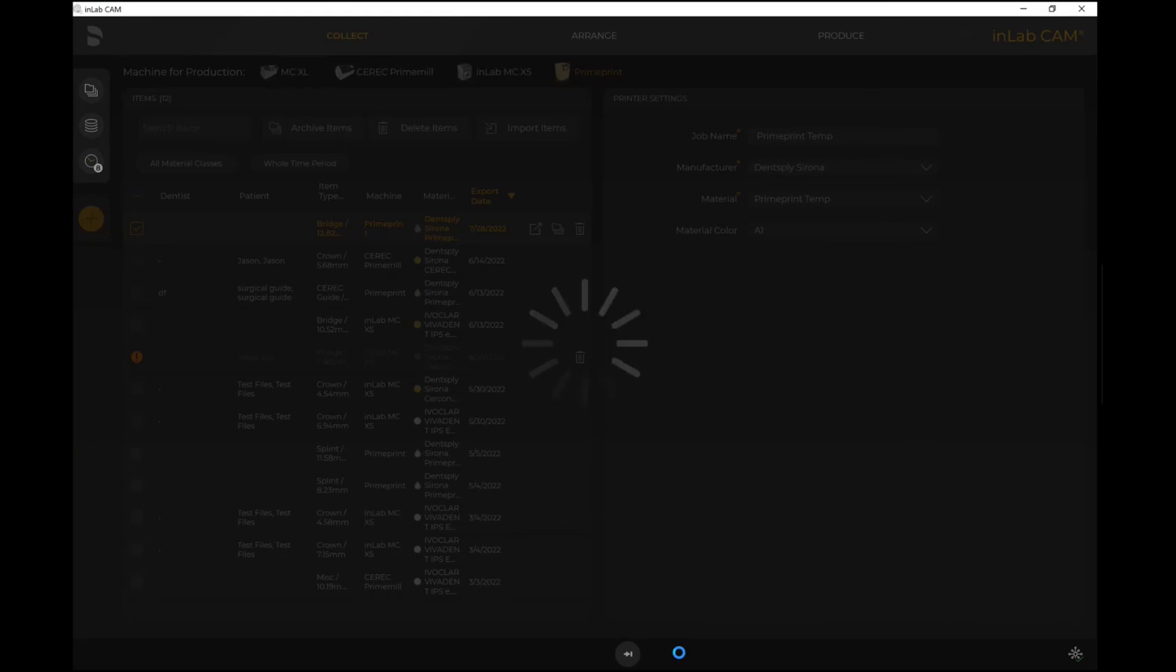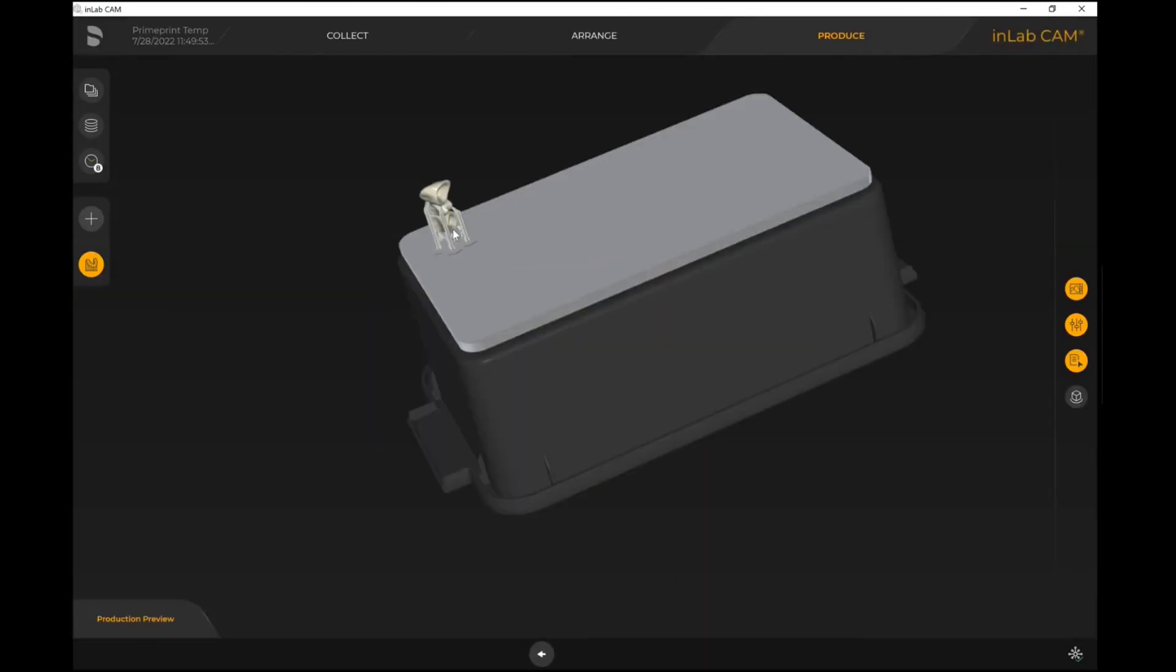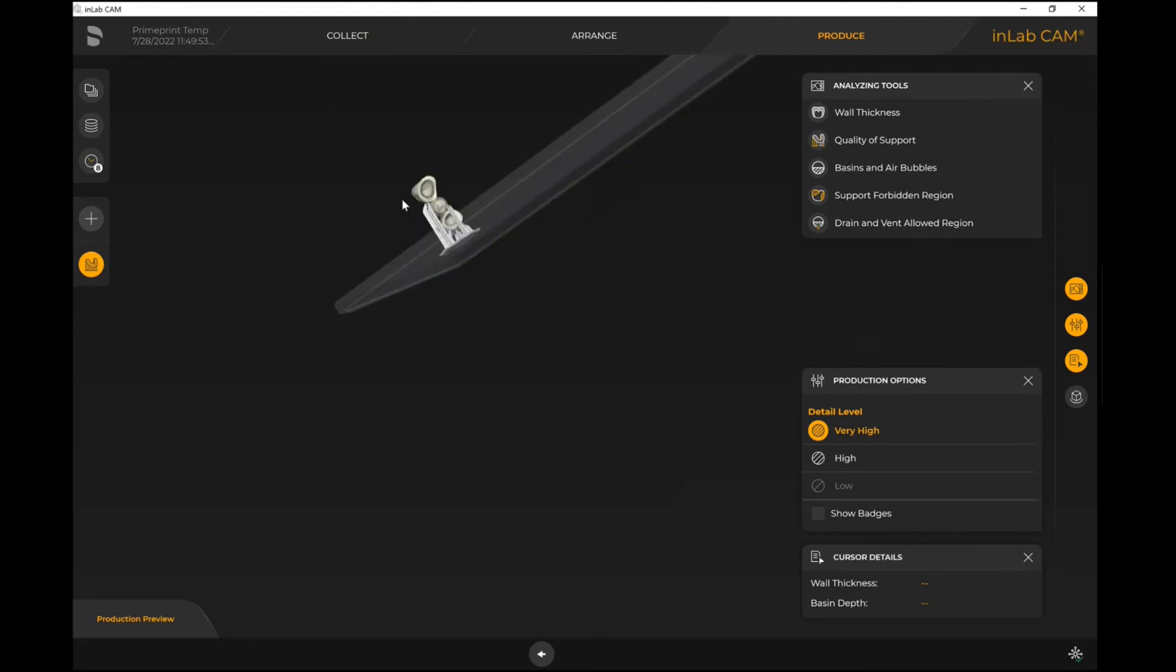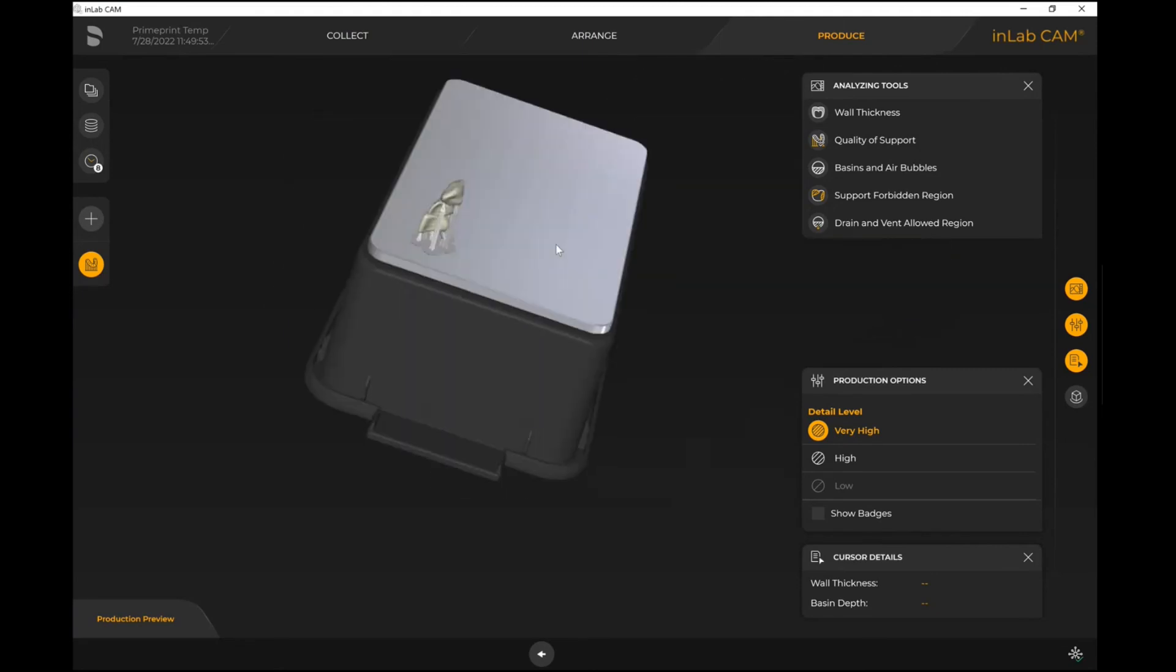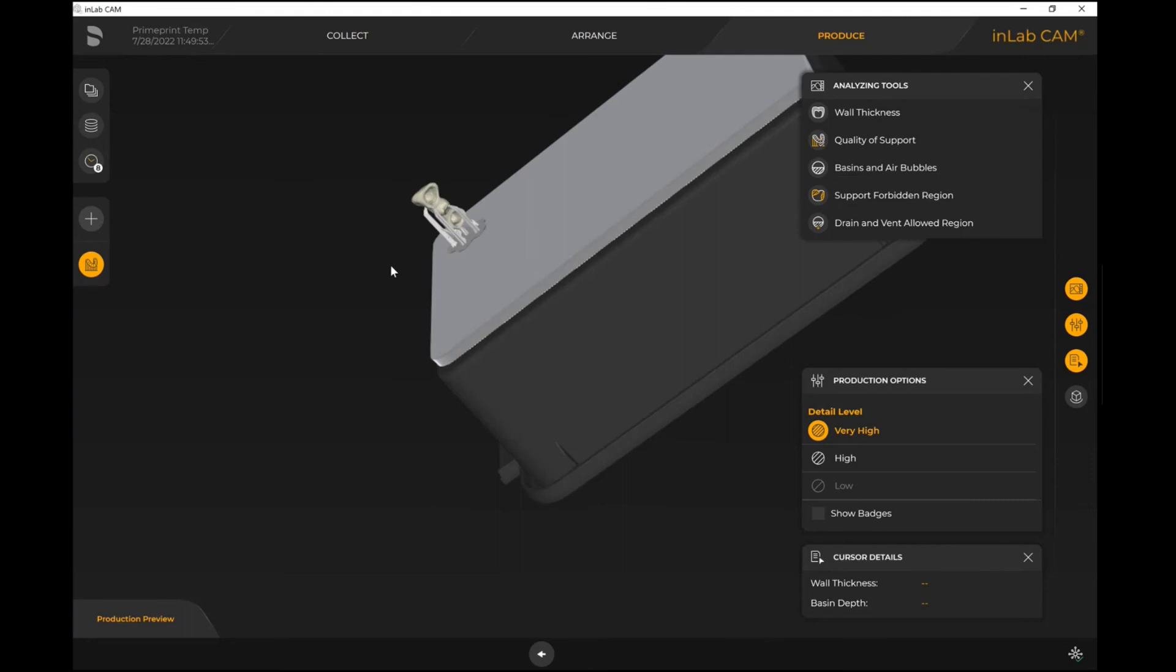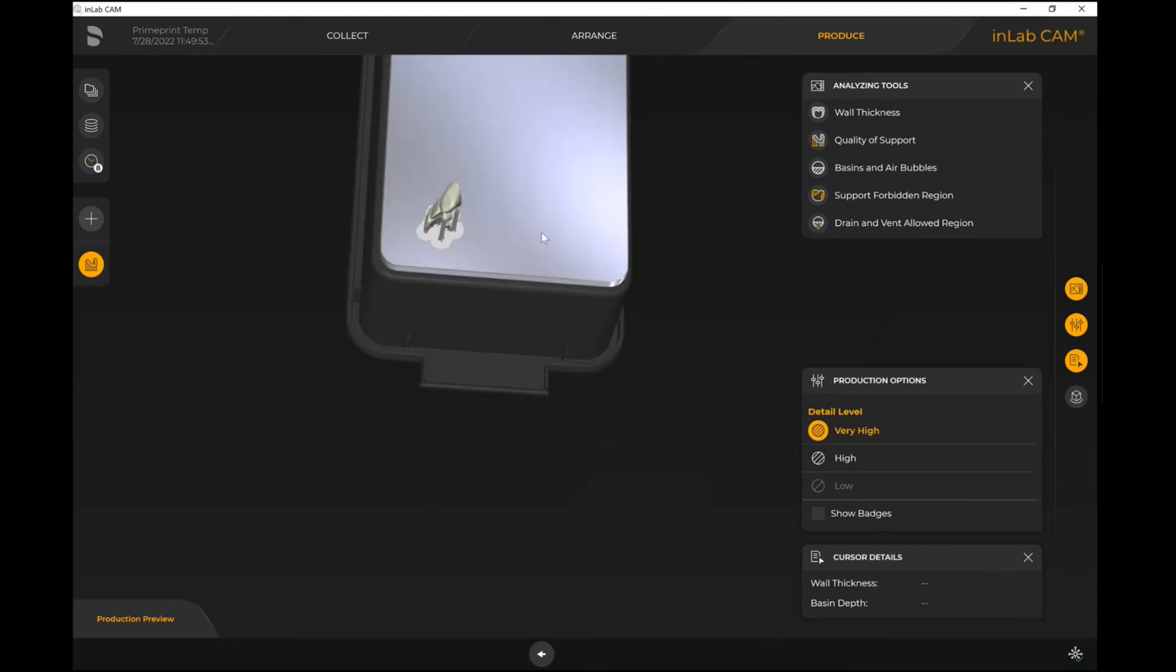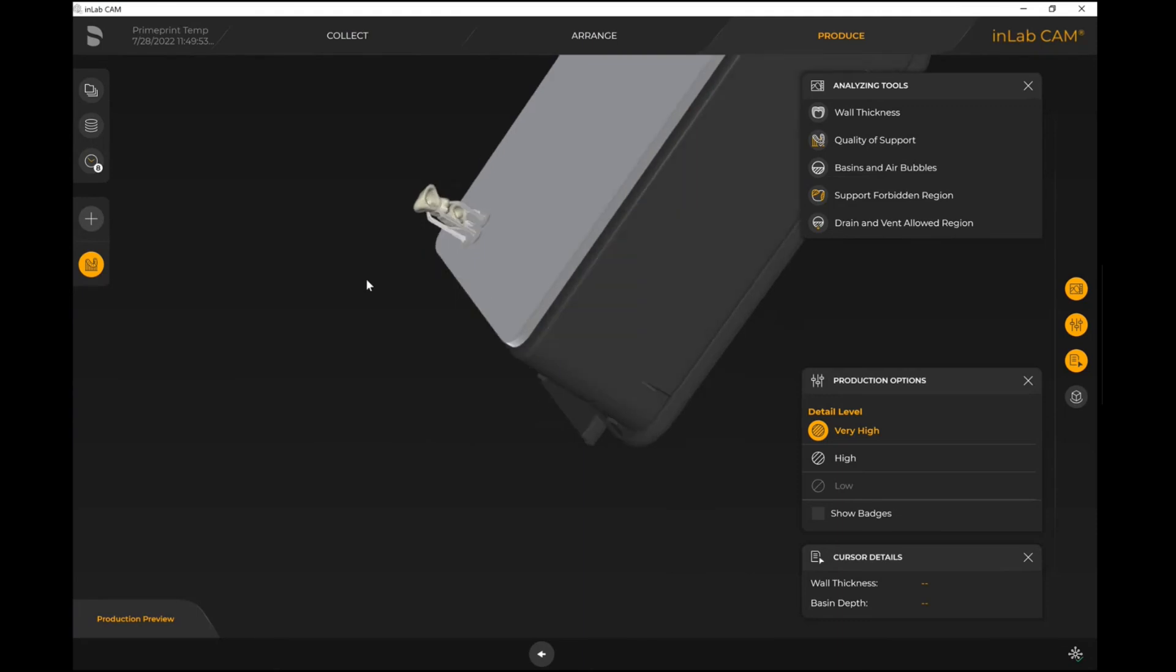There will always be additional information needed for certain types of files that you are importing. But once you have this here, we can see that it has not positioned any of the supports on the actual intaglio surface or the margins and things like that. So it's clear from those areas that we controlled with the additional information step.